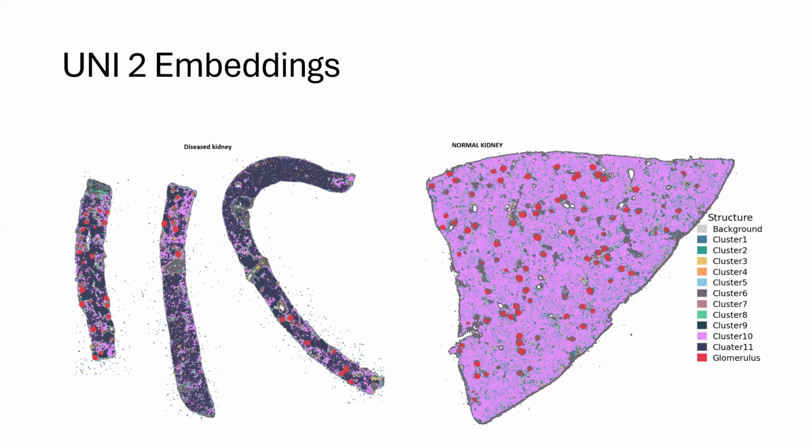But we failed to get the inside ones. Even though we can easily tell a normal kidney from a diseased kidney with the same artifacts, like the same model, it will predict normally the same colors, but we still fail to get what is inside that. So what is the approach? That should be more tricky. We have to find our own models to train, then it will find better ingredients inside the glomeruli.